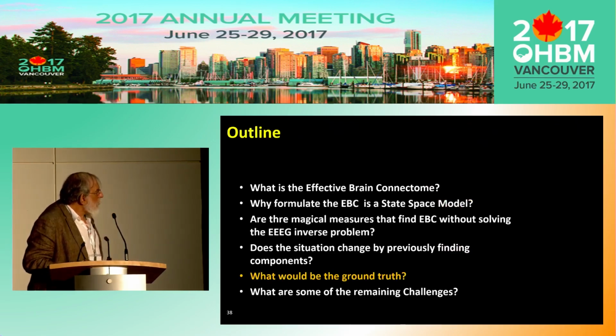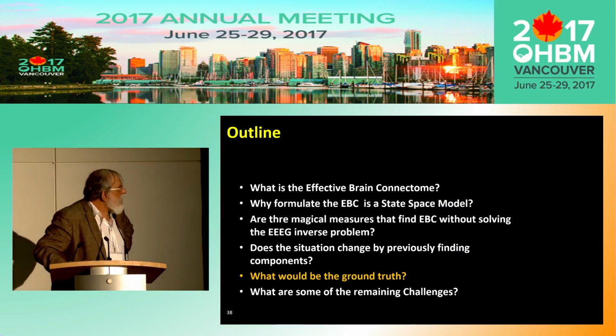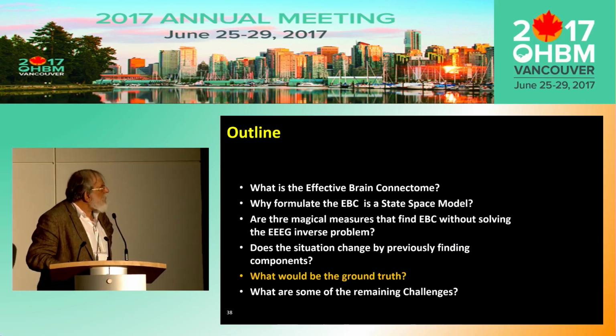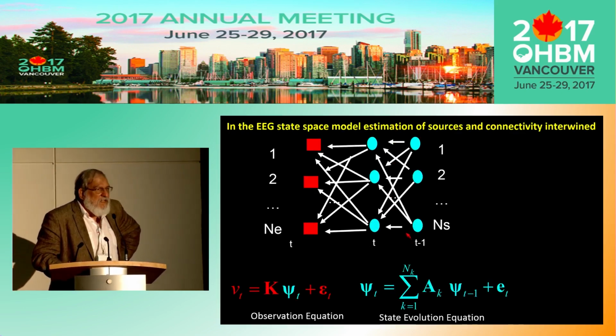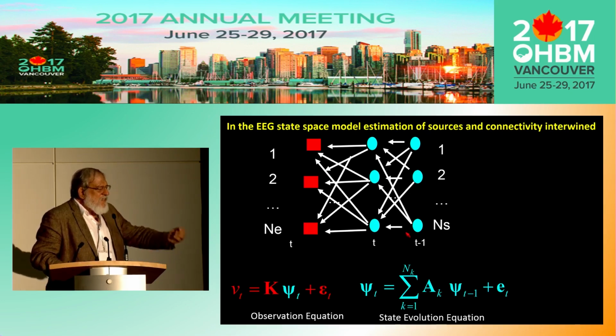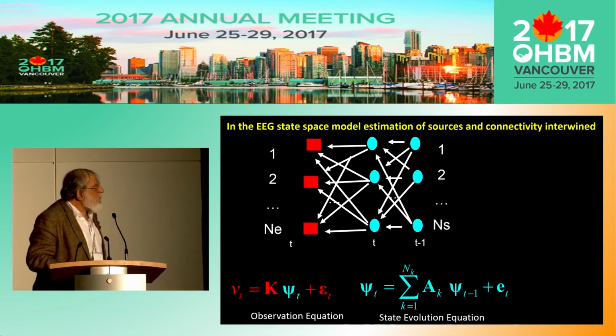Now, what would be the ground truth? I think we started seeing from Scott's presentation, it is simultaneous recordings. First, one of the problems we have to face is that we have to solve a large multidimensional problem. And I have to admit that there's leakage, there's a number of problems with finding connectivity in the inverse solution. But these problems have to be addressed.